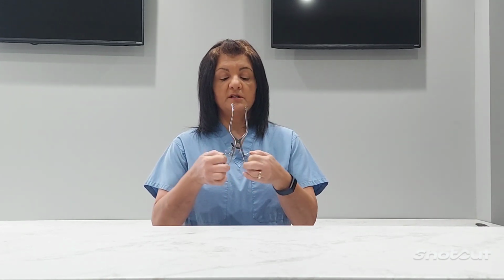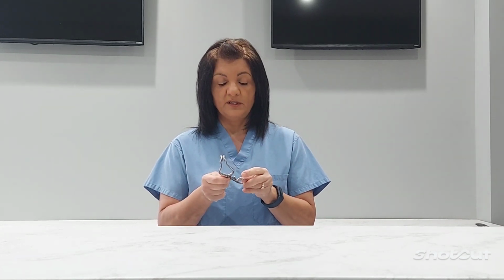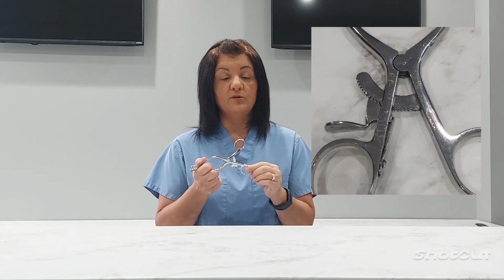The last item I wanted to talk about was the Weitlaner. It's also like your Gelpis with this special type of ratchet. You just kind of want to move it over, secure it, give it a pull. Again, you do the same inspection: pits, cracks, rust, and stains. I do see this one is engraved. Unfortunately, that makes our instruments unusable. We should never be using engraved instrumentation because that invites bioburden in and makes these instruments unsafe for our patients.